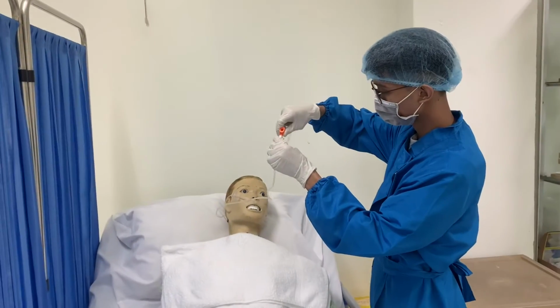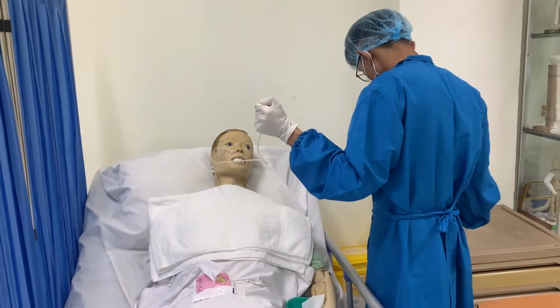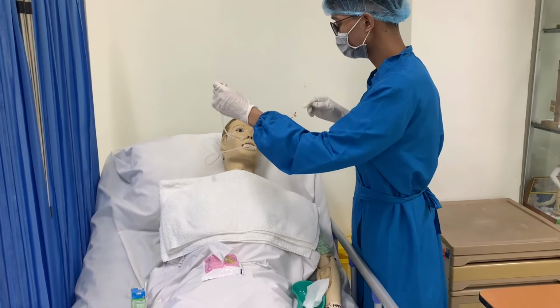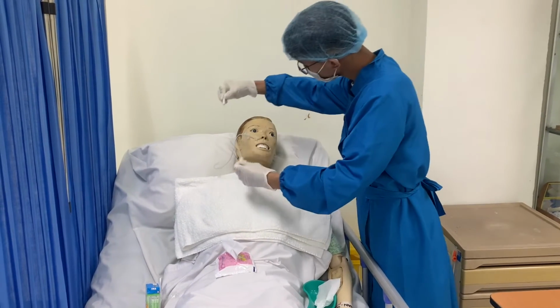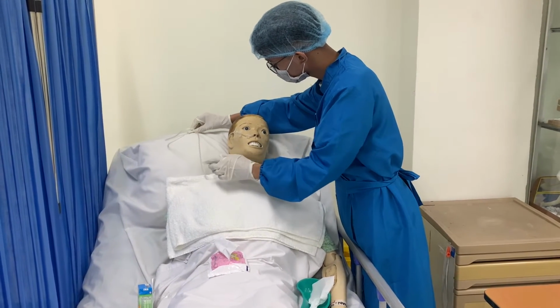Secure the tube to the patient's gown by using a rubber band or tape and safety pins. For additional support, the tube can be taped onto the patient's cheek using a piece of tape. If a double lumen tube is used, secure the vent above the stomach. Attach at shoulder level.